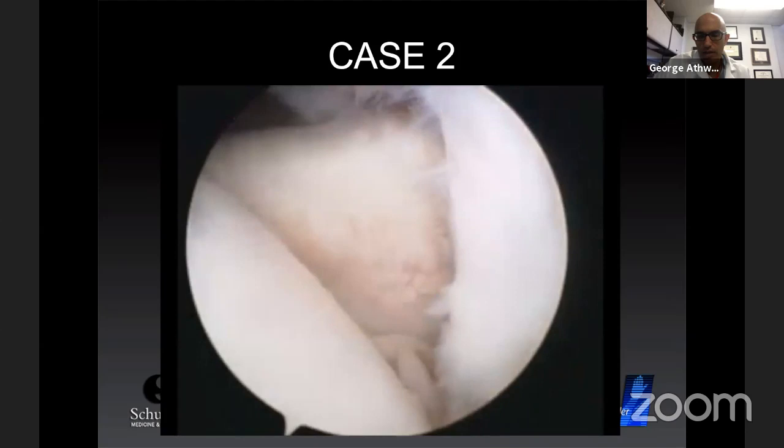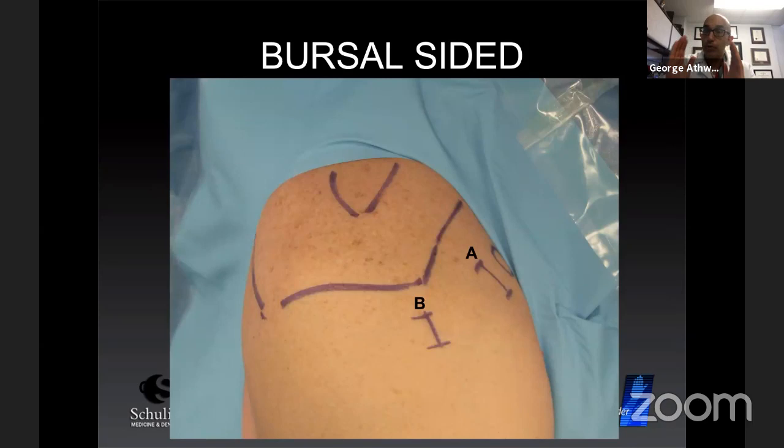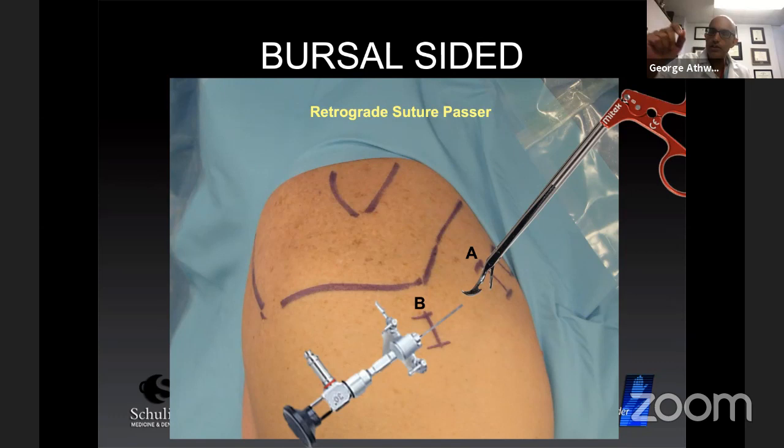So now that was the intra-articular repair. Let's go into the bursal side of repair. So with the bursal side of repair, there's really in general two techniques. You can view through an anterolateral or a subacromial portal like this. And then you can come in with a retrograde grasper to go through the tendon and pick up your stitches as you've already passed them.